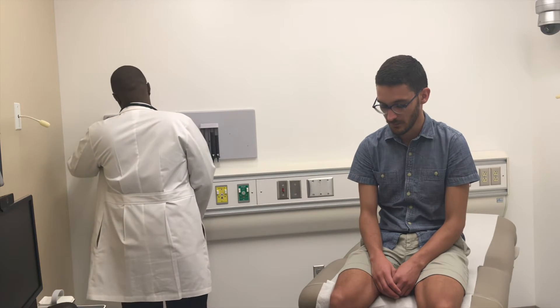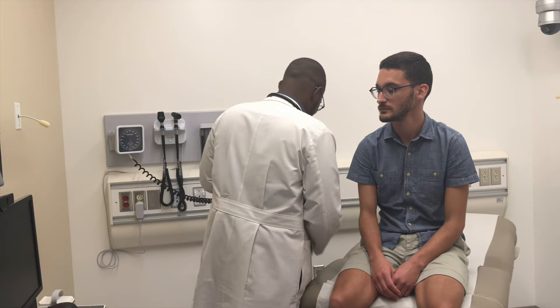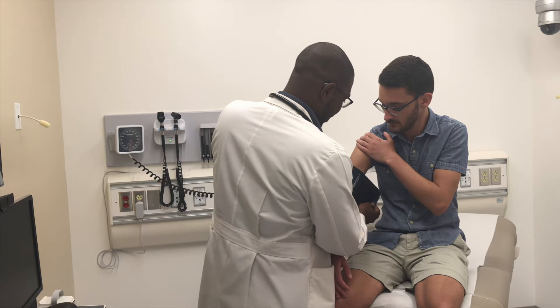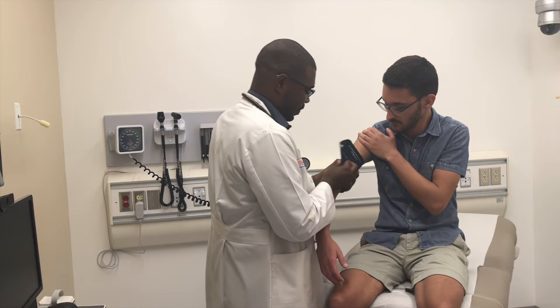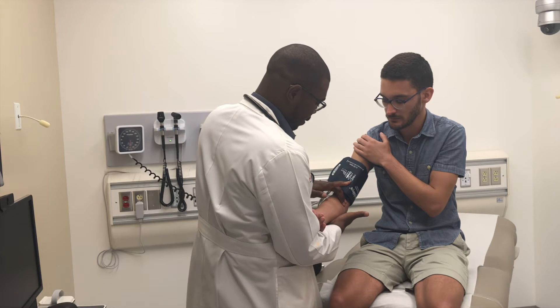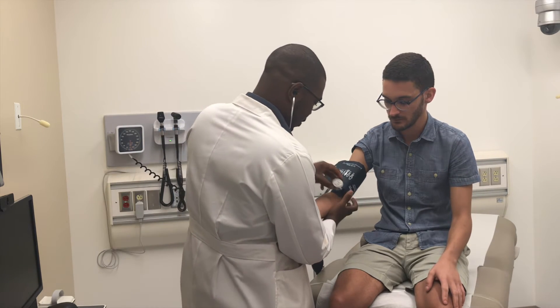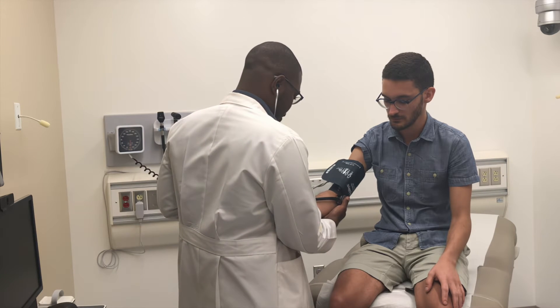Now we move on to checking the blood pressure. The doctor selects an appropriately sized cuff, and then makes sure to attach the cuff without any clothing in the way, snug but not tight, with the indicator mark in the correct position. With the cuff attached, he holds the patient's arm at the appropriate level, palpates the brachial artery, puts the bell of the stethoscope over where he just palpated the brachial artery, holding it in place with his thumb, then picks up the pump.